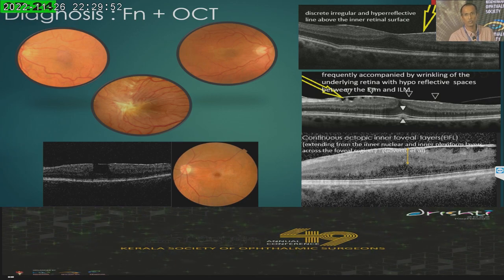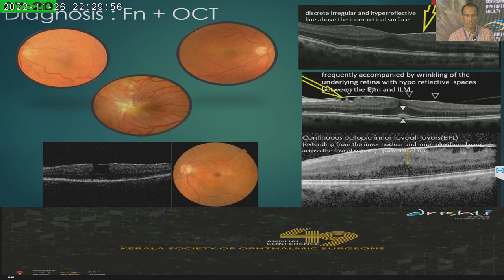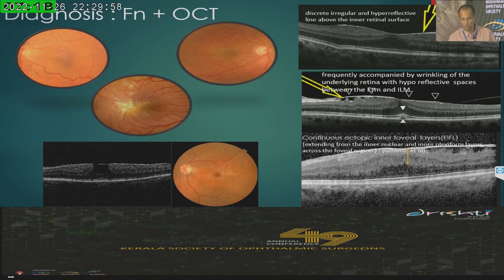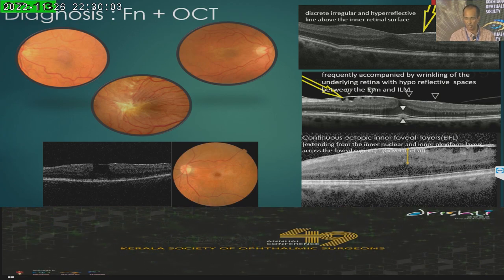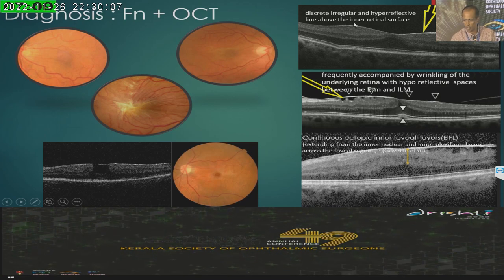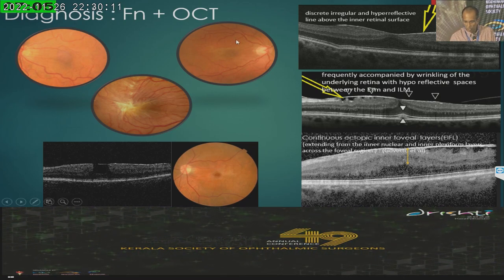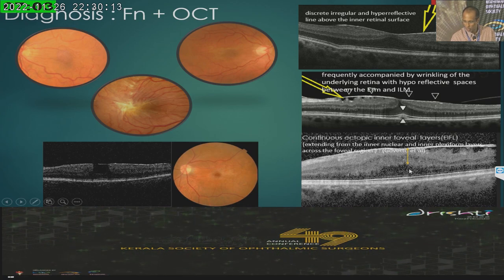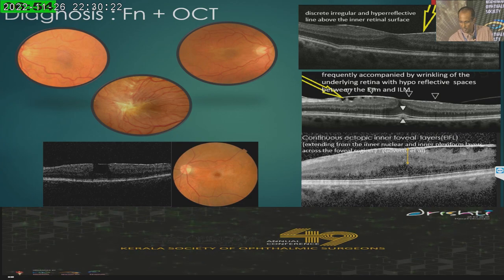As far as diagnosis is concerned, in the early stages it used to be difficult on fundus examination. But with OCT, it is quite easy — it is very well distinguishable as a discrete, irregular, and hyperreflective line. One thing I want to stress in the OCT is the presence of an ectopic inner foveal layer, or EIFL — a band extending from the inner nuclear layer and inner plexiform layer across the fovea.